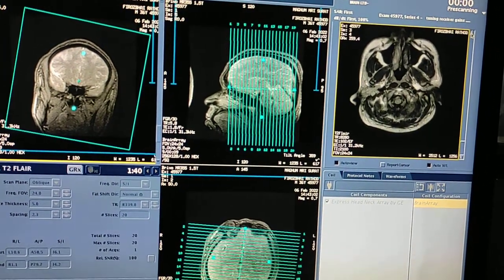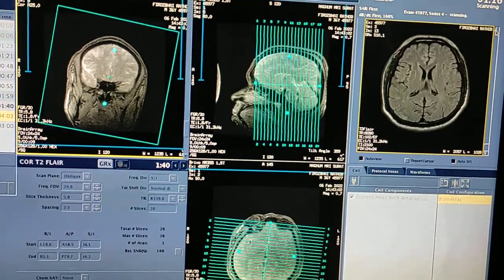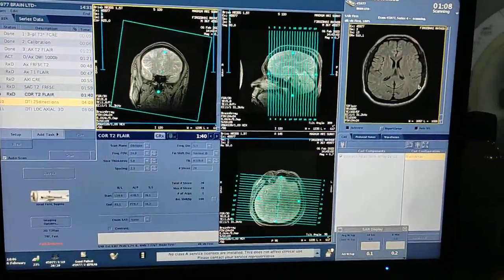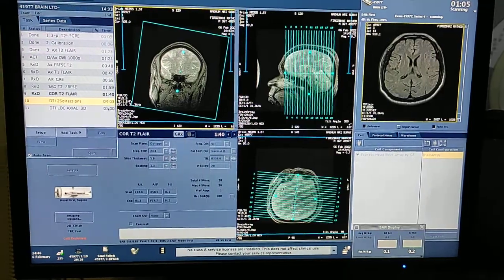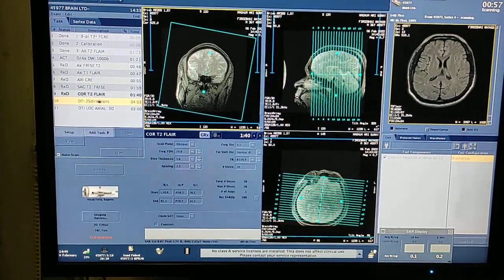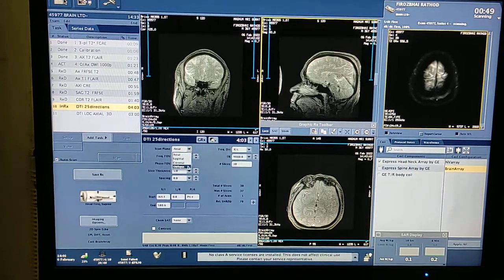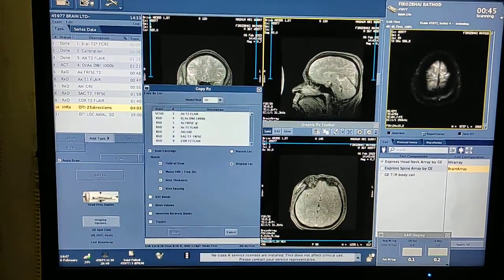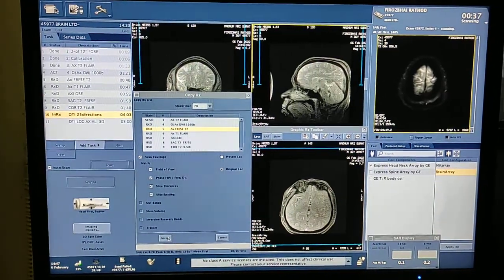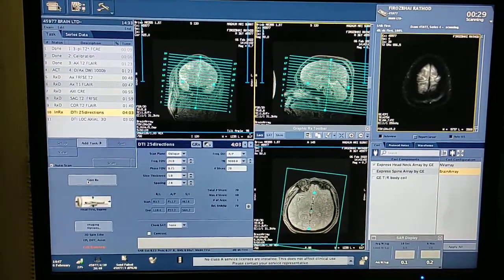The patient has a complaint of left side hemiplegia. See, there are multiple acute infarcts — slight motion artifacts are there, that's okay. Now I am planning DTI. Double click on the DTI sequence — simply you have to copy like we have done from other sequences. Double click, open, click on the RX box, take any sequence you want to copy — I am taking T2, accept. See, DTI sequence has been planned. Save RX.